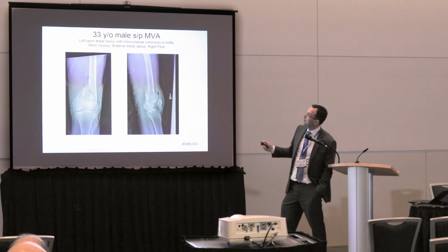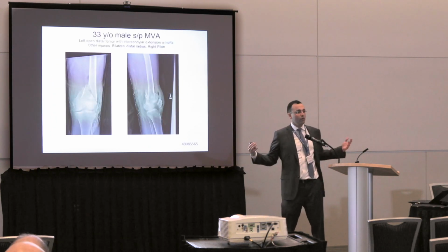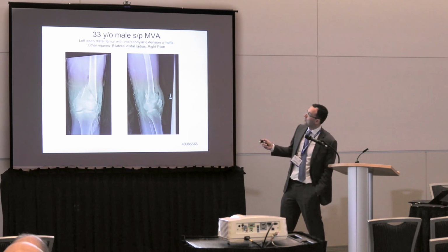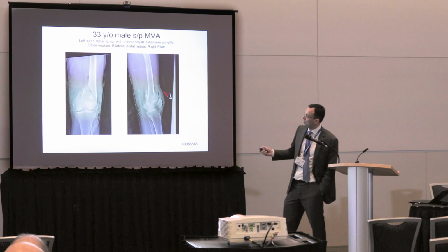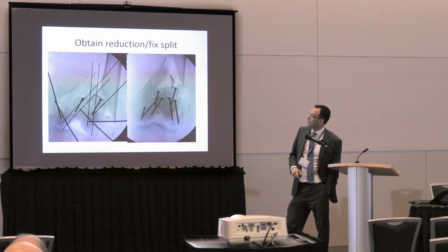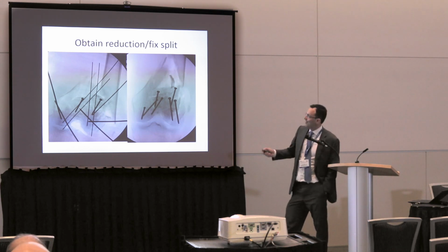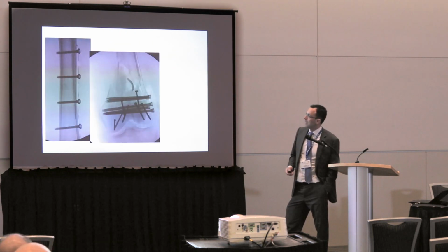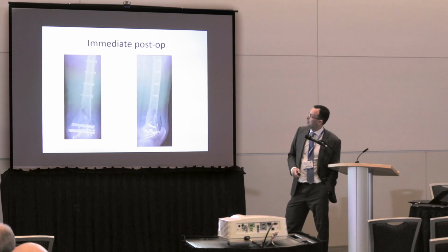So a 33-year-old, and so this isn't just for the old, torn up patient or simple fall. This is a patient who has everything broken, right? You just see this. It's destroyed. Open fracture. It's a sign of a surgeon struggling, right? So many K-wires. So that's me right there. And again, very similar technique like you'd use. And here we go, immediate post-op.